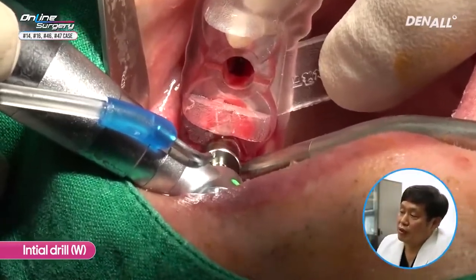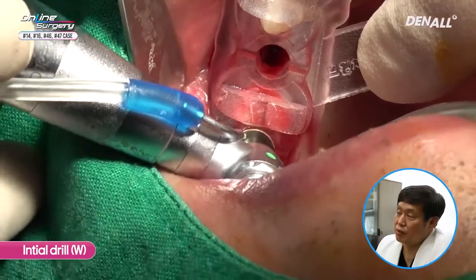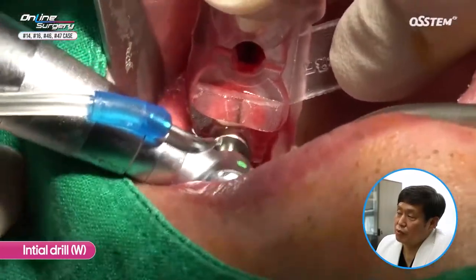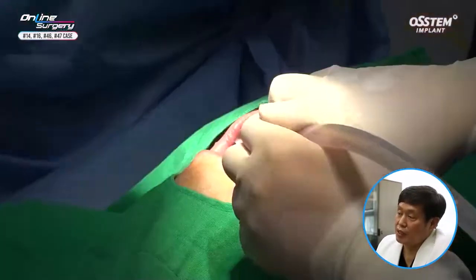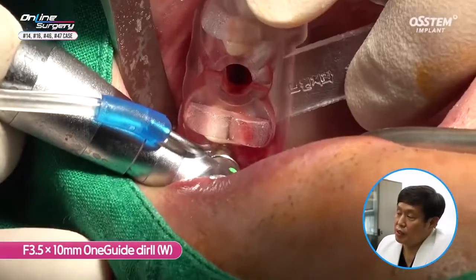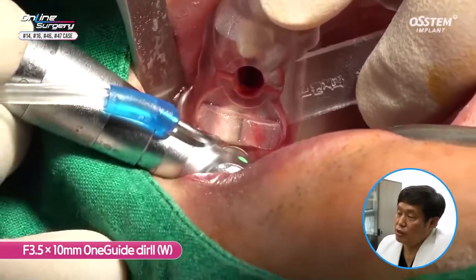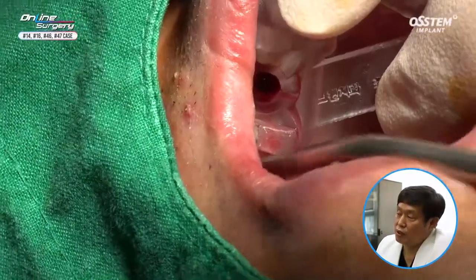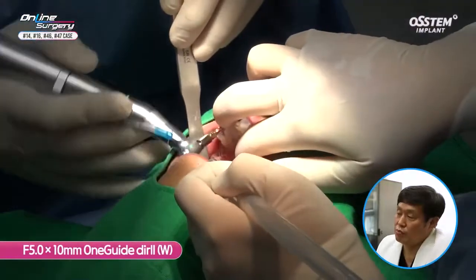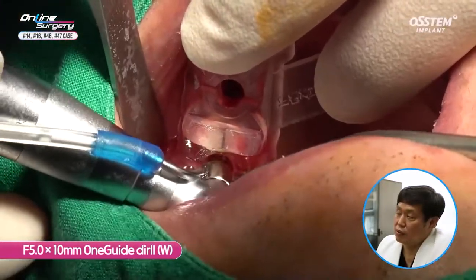Initial drilling is done in number 16. The bone quality is much better here. 3.5 by 10 millimeter. One guided drill is used for drilling. Pumping action is done to prevent heat generation. 5.0 by 10 millimeter OneGuide drilling is done. OneGuide drill is used.